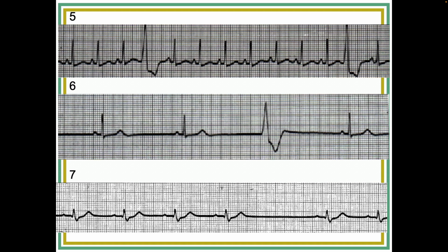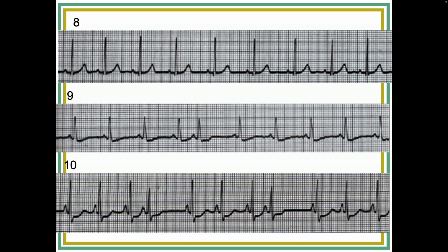So what I would call it is a borderline sinus brady. Again, you can say normal sinus, it's right on the border, with a sinus block or a sinus pause. Okay, moving along.